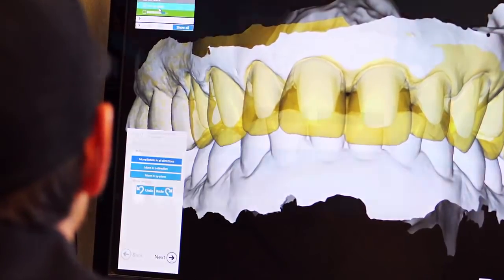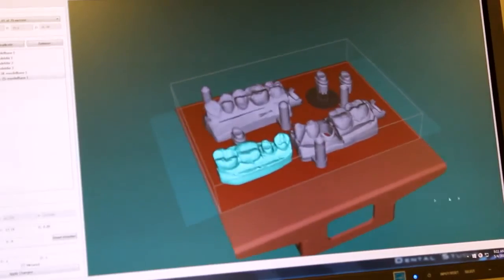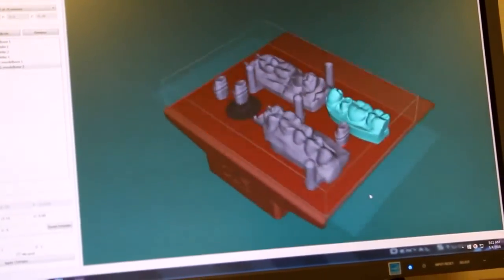We can import your files into the B9 Creator software to put them on your build table. It's super simple. You don't have a burr, you don't have anything chopping away at a structure — you are creating something from nothing.